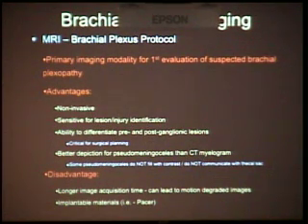The disadvantage, the patient has to lay there longer. A lot of them are in a lot of pain, and you may not get great images. They're motion sensitive. And then again, patients who just can't get in there because they have a pacemaker that's not MR compliant.